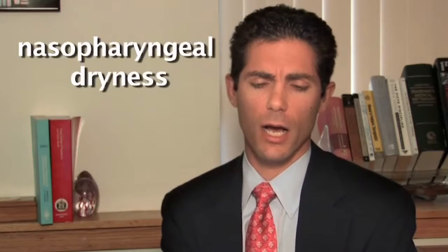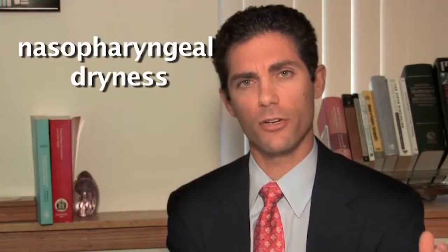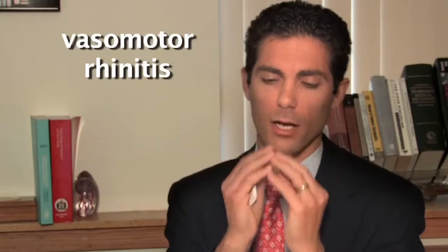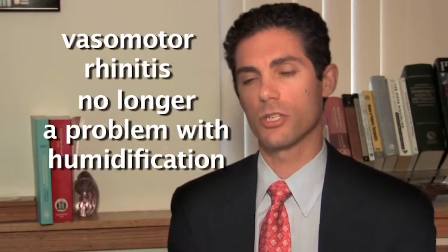Nasopharyngeal dryness in the past has been a concern, but most of our BiPAP machines and our ventilators that are BiPAP adaptable now have humidification, so that's no longer really an issue. And vasomotor rhinitis, conversely, as someone comes off the BiPAP and their nasopharynx vessels vasodilate after being on BiPAP, patients would complain of rhinitis. Again, because of the humidification, this is rarely an issue these days.